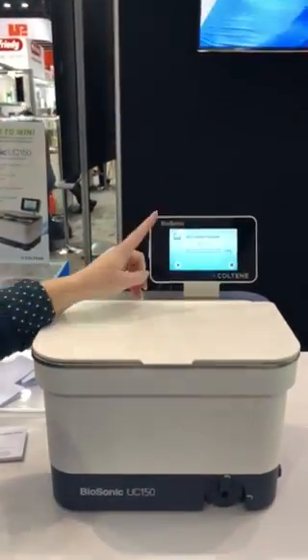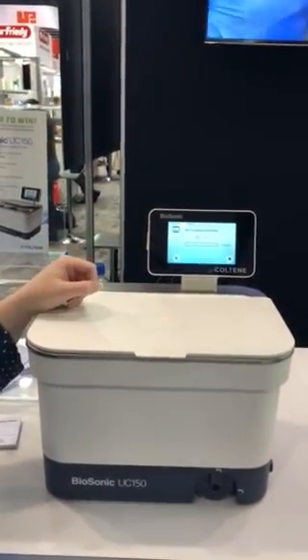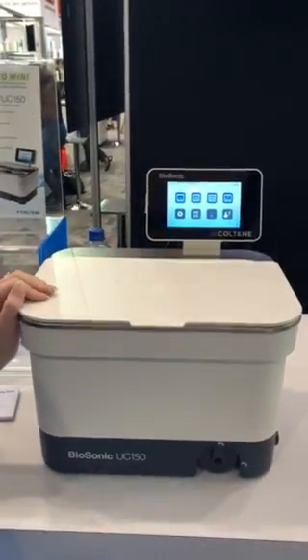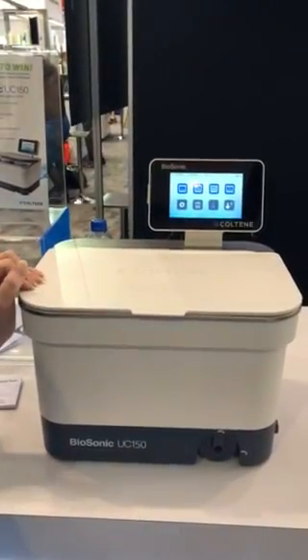It also has a My setting, so you can set your own time and temperature. There are also three standard settings, depending on your size and the dirtiness of the load.